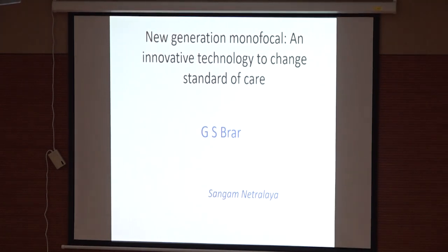And the world is trying to revisit the spherical aberrations to give the patient better pseudo accommodation, and also trying to minimize the nighttime issues and the issues of glare and halos with these IOLs.